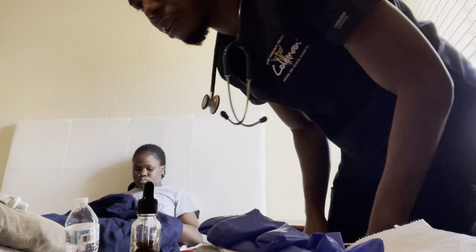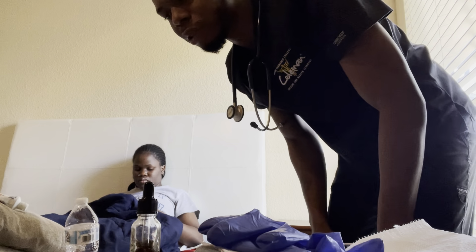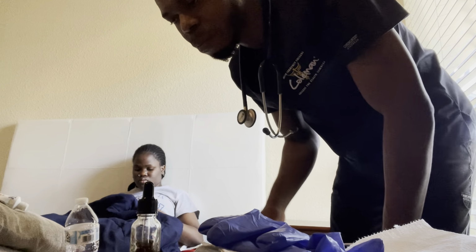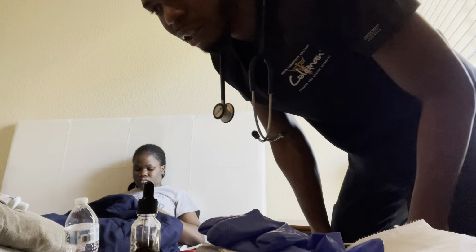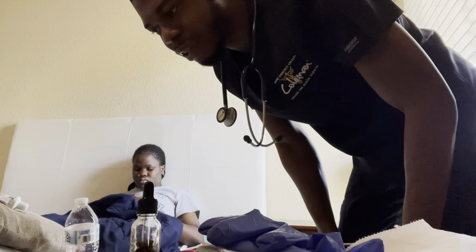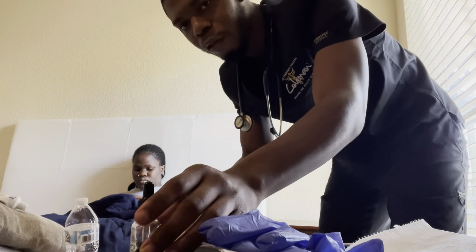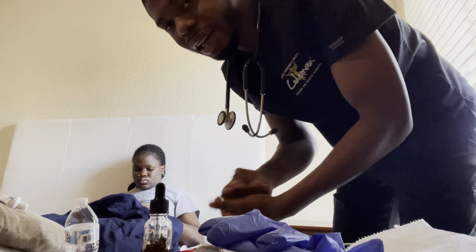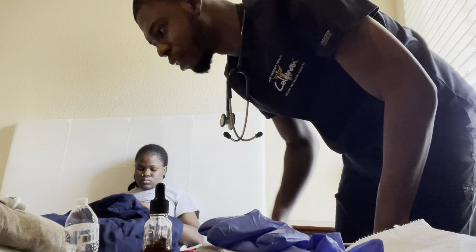After I'm done listing out the equipment, I will be on my way to the patient room. I will knock on the patient door in order to ensure the patient privacy. When I get into the patient room, I will close the door behind, still to ensure the patient privacy. Before I approach the patient, I will perform hand hygiene by using my hand sanitizer. Now that I'm done performing the hand hygiene, I will approach the patient.